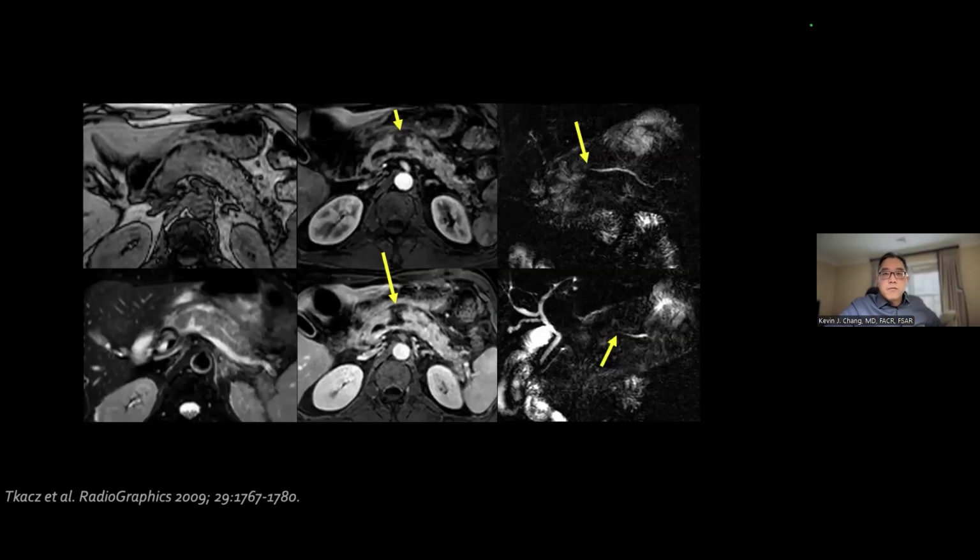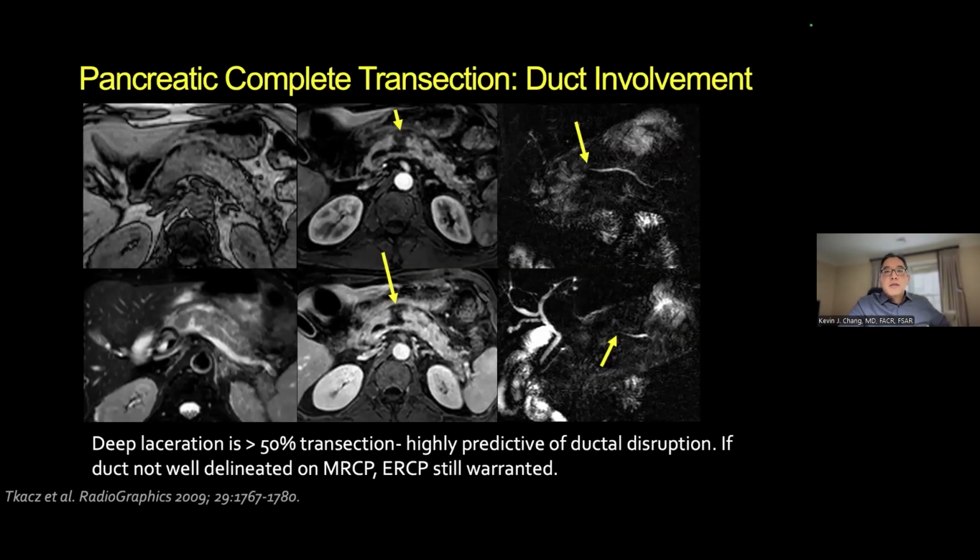And oftentimes the diagnosis is delayed because there are usually multiple other associated injuries when you do see a pancreatic duct or pancreatic laceration: hemorrhage in other organs, fistulas, abscesses, sepsis. There's a bunch of other complications that are generally seen in these kinds of patients, with a very variable and non-specific clinical presentation. And then that might prompt an ERCP to actually demonstrate the ductal leak directly with a contrast injection.